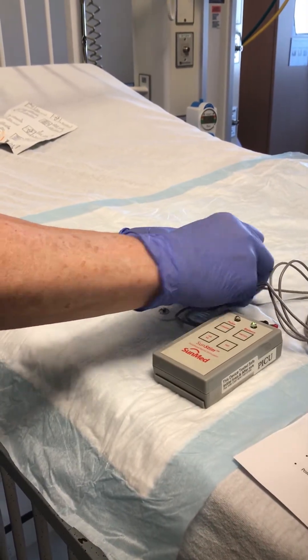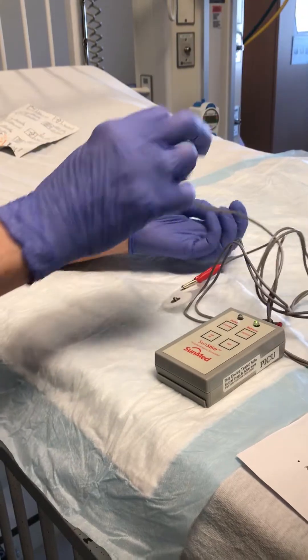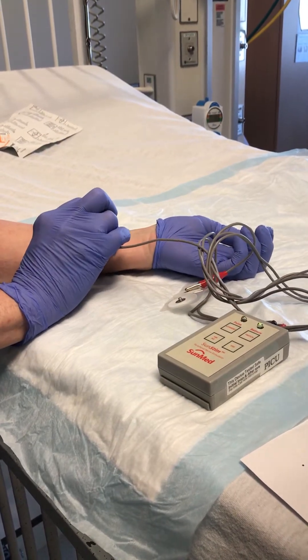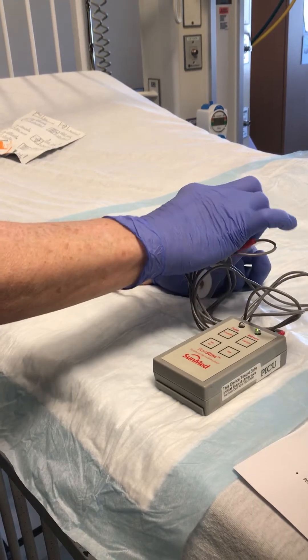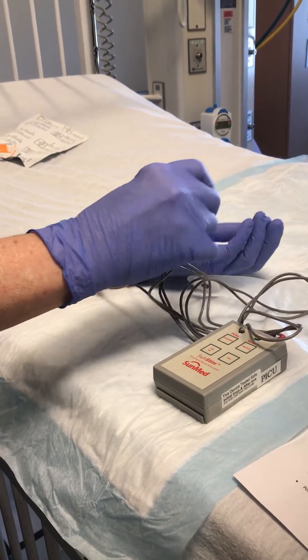The black is the negative and goes distally over the ulnar nerve, and the red is the positive and goes in the fold.